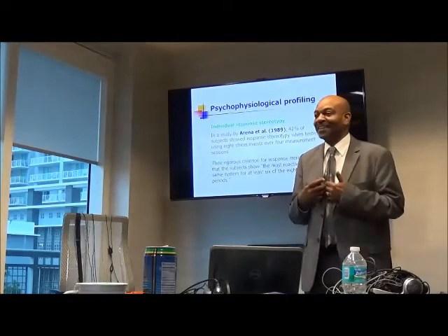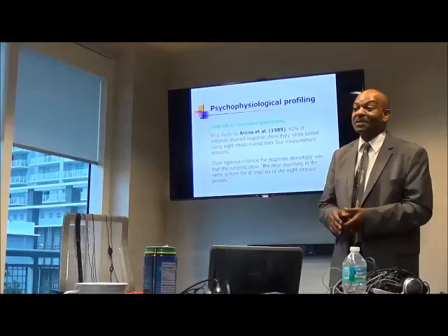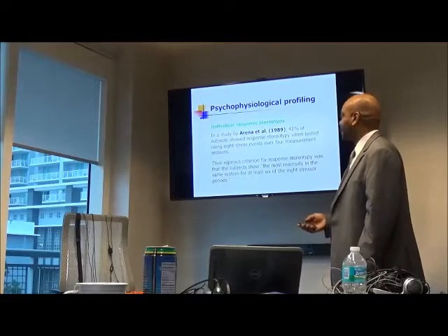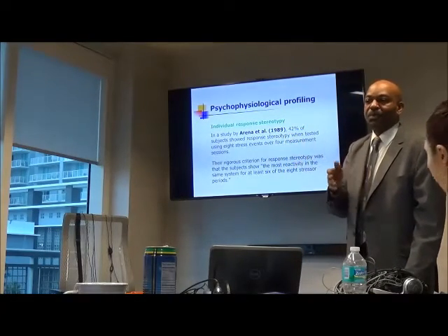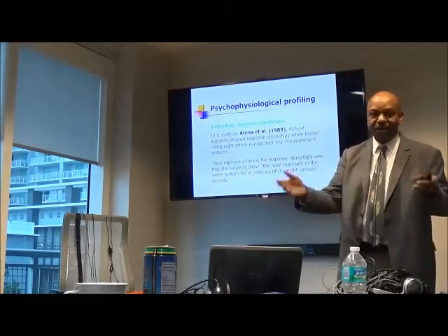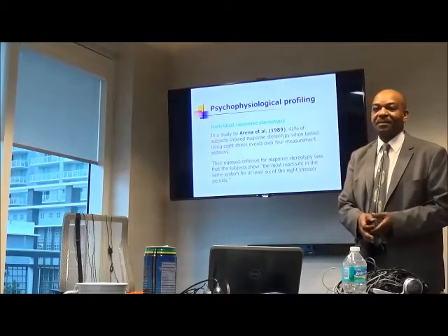And I felt like the worst person in the world for making them do this. But, so the different people react different to the same thing. So you don't know what to expect. You're going to find very different situations with different people that you work with. So, there could be a study that shows that this is what they found, but when you do the tests with the people that you're going to see, you're going to see many different situations.